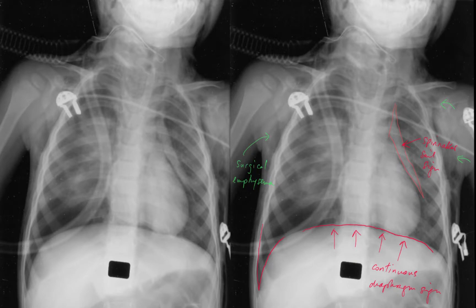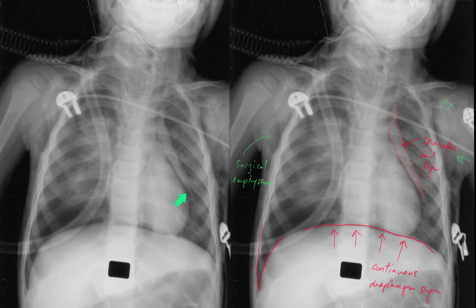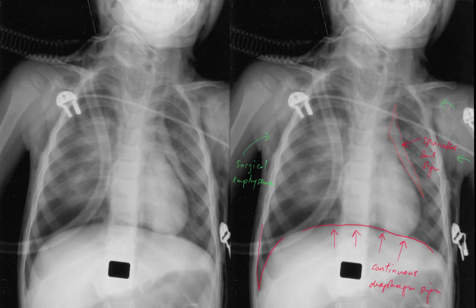This patient has a deep sulcus due to a pneumothorax and they've got the continuous diaphragm sign. They've also got a thymic sign, which is being stripped off the mediastinum by the pneumomediastinum. Note also the surgical emphysema. This was a young child who had a tracheostomy secondary to epiglottitis, and the barotrauma of positive pressure ventilation led to a pneumothorax and pneumomediastinum.